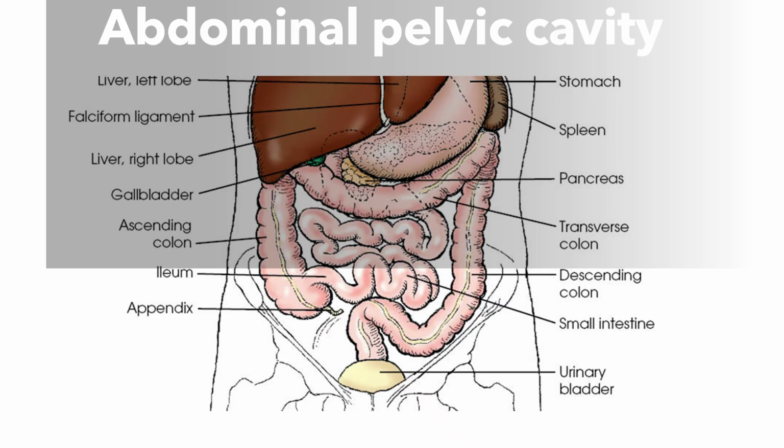The liver is fairly consistent. The liver shows up as a gray triangle in the upper right-hand corner. Okay. The stomach usually has an air bubble in it, so we can see the air bubble in the stomach. Okay. Spleen depends on how large it is. Sometimes it hides behind the stomach and you don't really see it that good. Sometimes it's really obvious. So it's hit or miss with the spleen. Pancreas, you're never going to see a pancreas unless it's being highlighted by contrast, but we'll get to that next year. Okay. Large colon is usually filled with air.